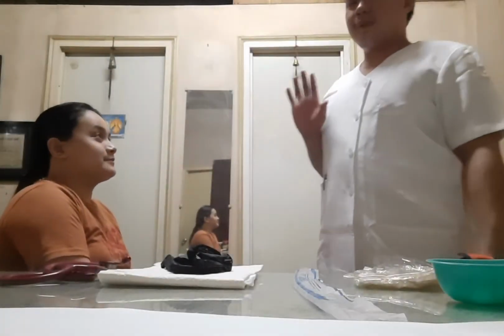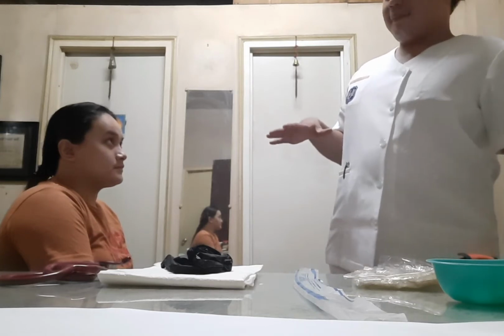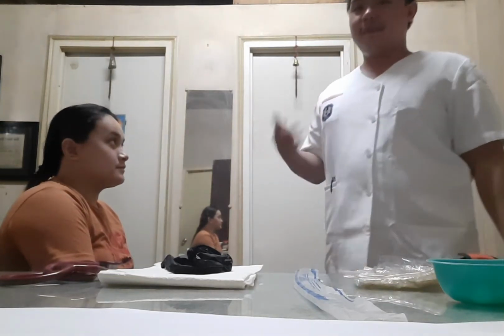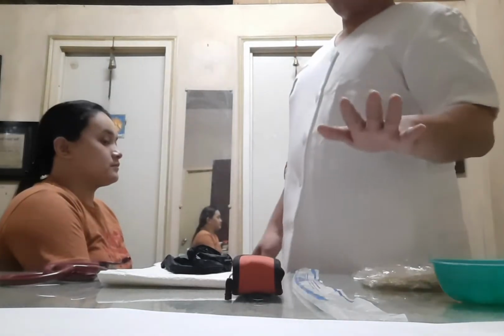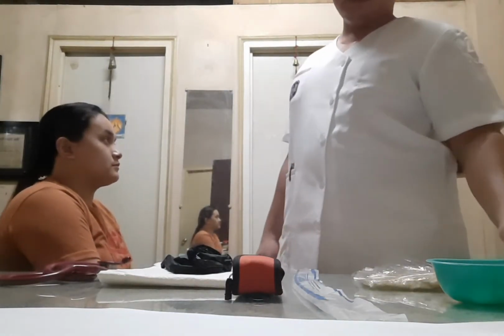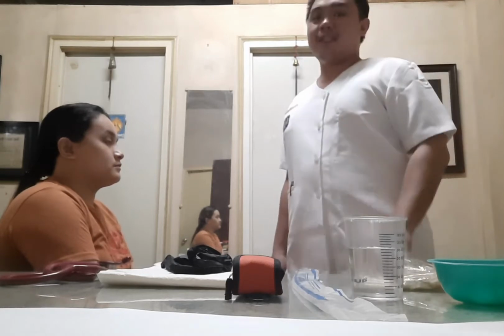I will be going to my patient, and so assuming that I am already in the patient's room, assuming also the patient is already in the semi-Fowler's position because I don't have any hospital bed available in our house, and then assuming that this is also my bedside table where all my materials gathered and needed are here before the procedure.